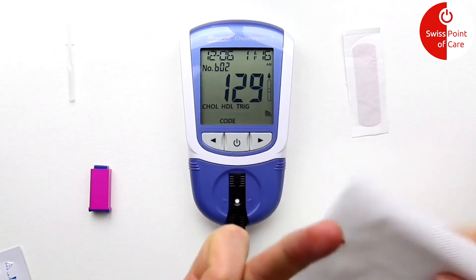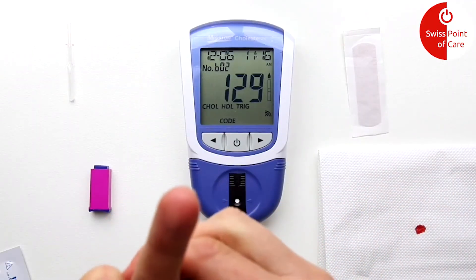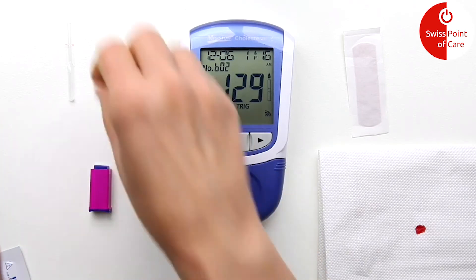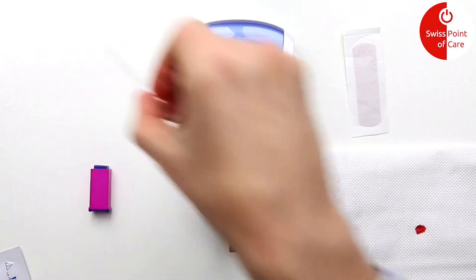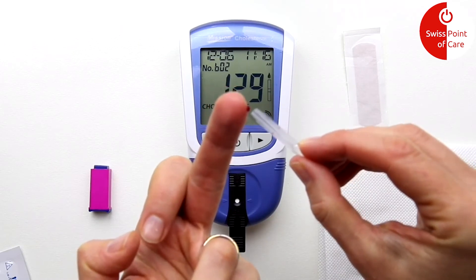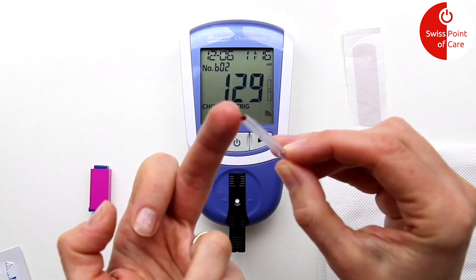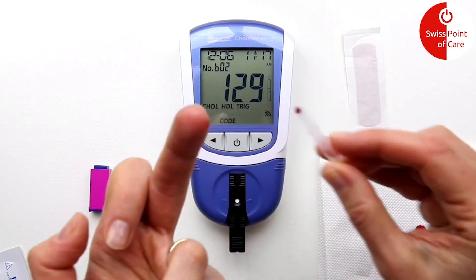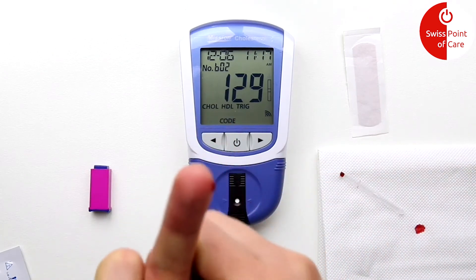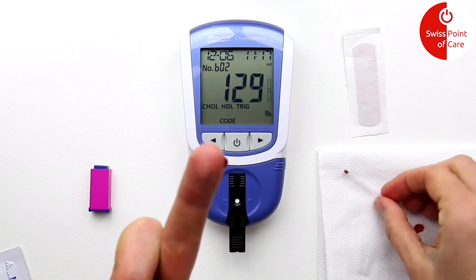You can wipe away the first drop of blood, then massage the hand and finger to create a second drop. It is important that the blood drop is round and does not run. You can then hold the tube, open side up, to the blood drop. The tube must be filled up to the line. You can massage the finger to get enough blood. You do not need to press on the tube — the blood sucks itself in.